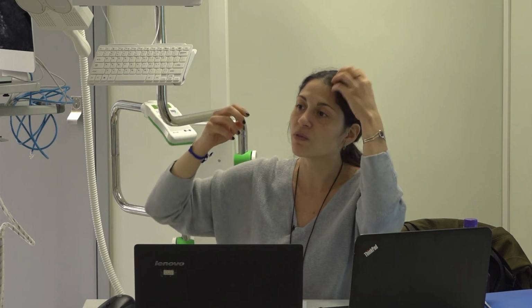So you can use TMS for several things. You can use TMS to check, okay, I want to see working memory. If working memory is connected to parietal, or if the parietal region is related to working memory, I apply one stimulation method that will inhibit this area. Is there a decrease in reaction time, an increase in reaction time, a decrease in accuracy? You try to check all these things with TMS. You cannot have this with any other method, like imaging. That was your question? Yes.